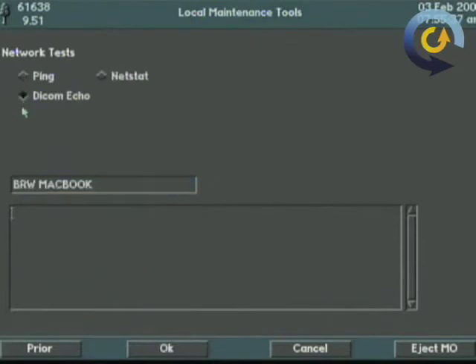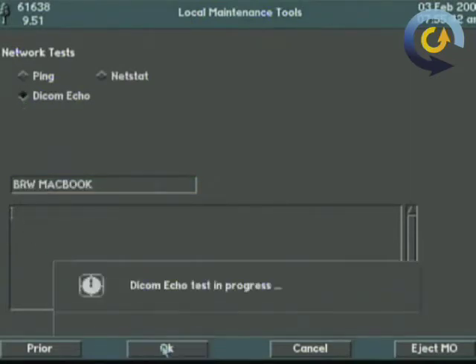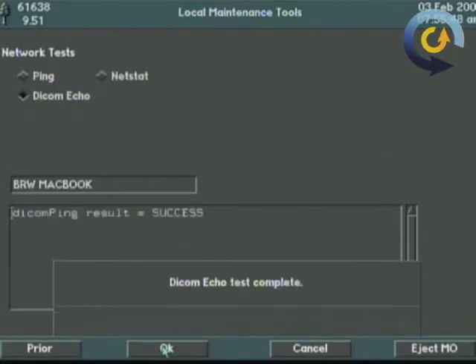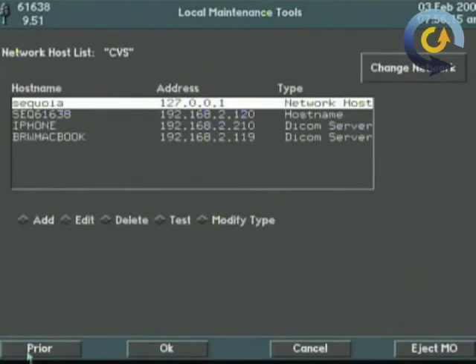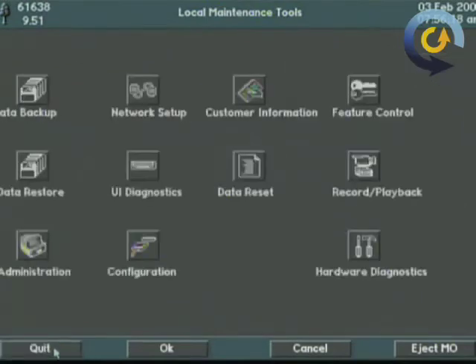Hit prior. Now we're going to do a DICOM test. DICOM echo checks to make sure that all the software handshaking is correct as well. That typically is things like AE title. DICOM result successful in this case. Very good. You've now set up the IP address of the system. You've set up the DICOM and you've made sure they were connected.